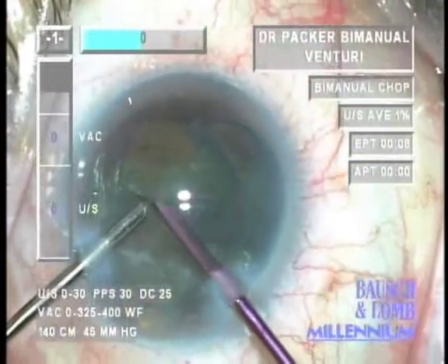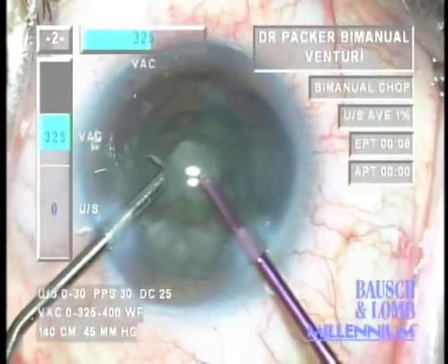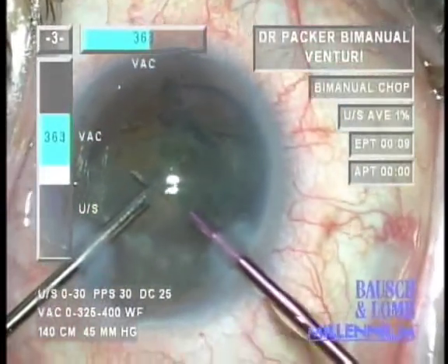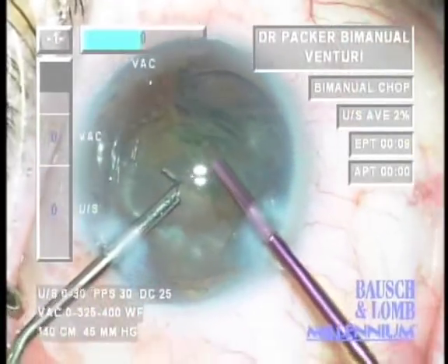This is achieved by virtue of the clear cornea and also the use of accurate biometry, IOL power calculations, and in many cases multifocal or accommodative lens technology, which also allow distance and near vision without spectacle dependence.